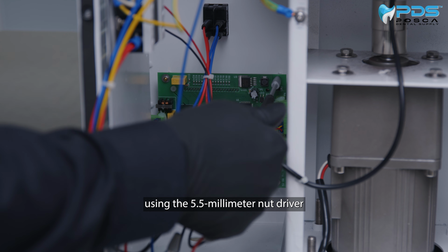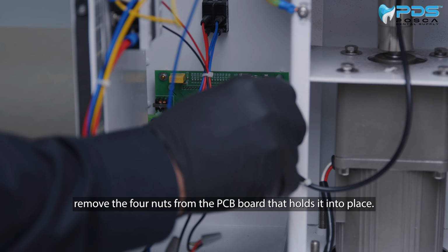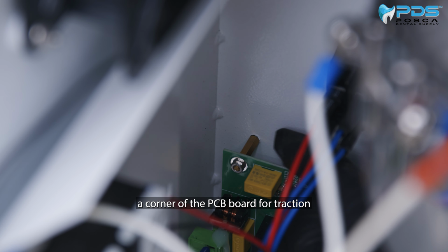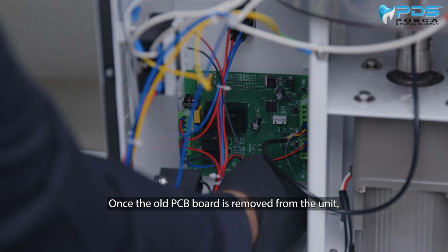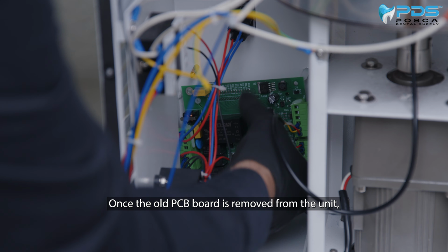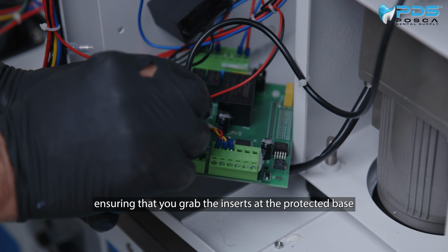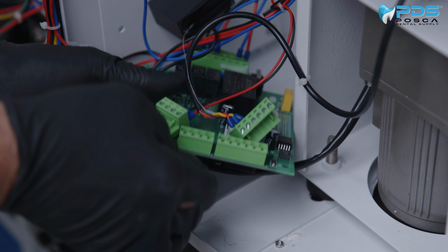Using the 5.5mm nut driver, remove the 4 nuts from the PCB board that holds it into place. You may need to carefully hold a corner of the PCB board for traction to be able to remove the nuts. Once the old PCB board is removed from the unit, remove the green electrical inserts one by one, ensuring that you grab the inserts at the protected base and not at the wires.